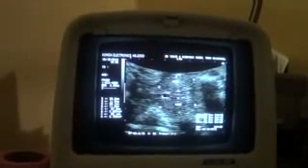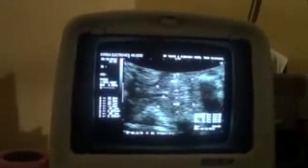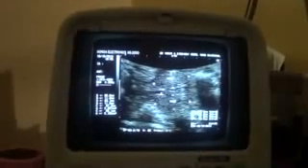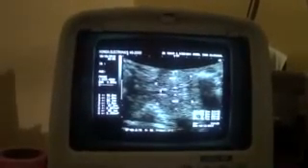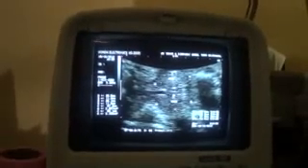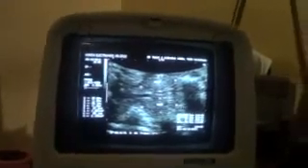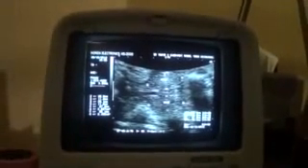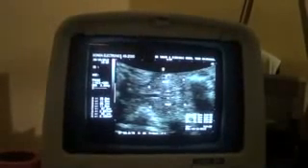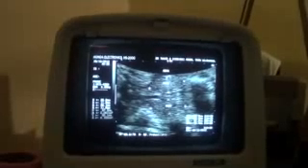If it had been a trachea, then in that case we should have been seeing air and the air shadow. There is no air shadow seen in this region. So this is a vessel entering the heart. The bilobe, evenly echogenic mass with no calcification or any cystic area within it. And this is a neck mass, region of the neck. So this is the main issue in this.